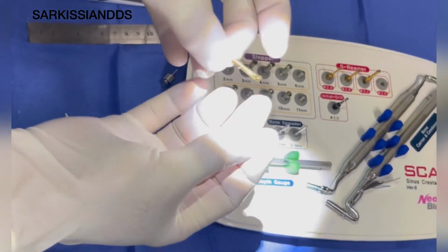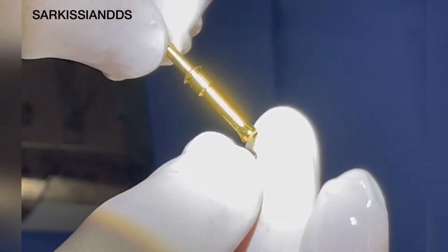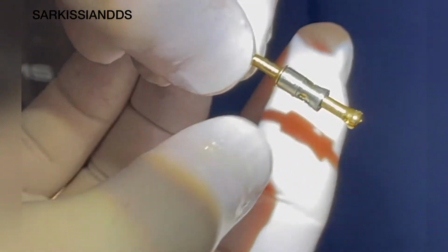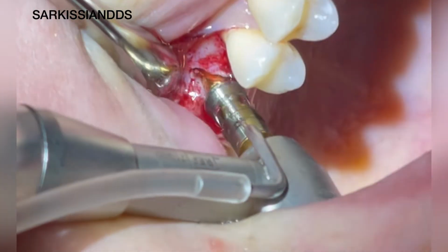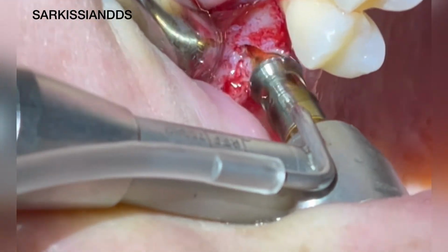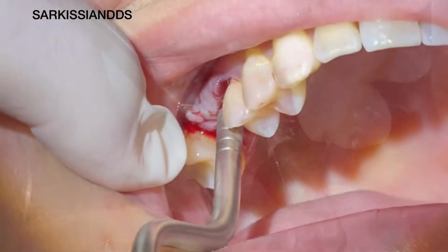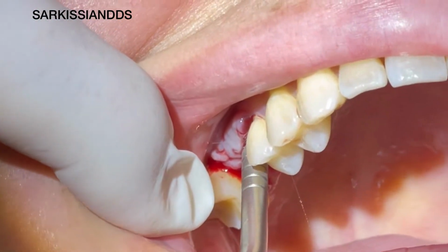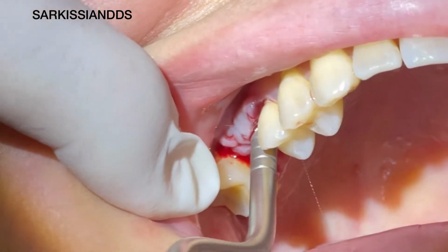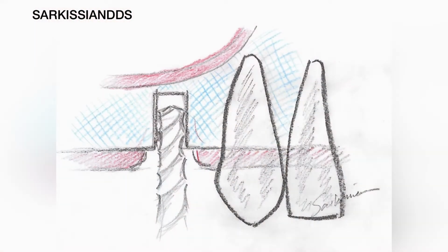After taking our first X-ray to confirm depth, I continue the osteotomy with the side-cutting special burrs from the Neobiotech crestal sinus lift kit. The stop is now set at the D1 depth. I proceed with a combination of bone stretching and burrs in sequence until I reach a diameter to allow a tight fit of the final bone punch.